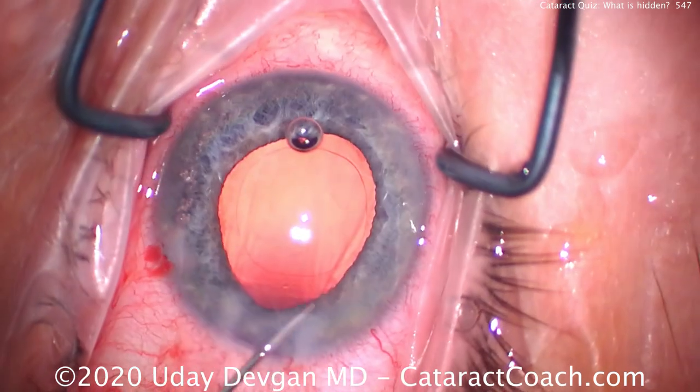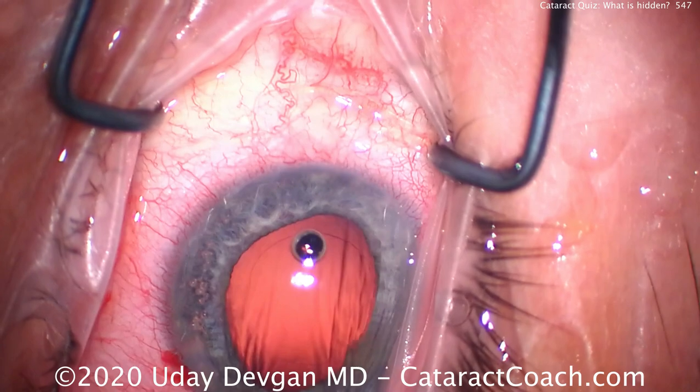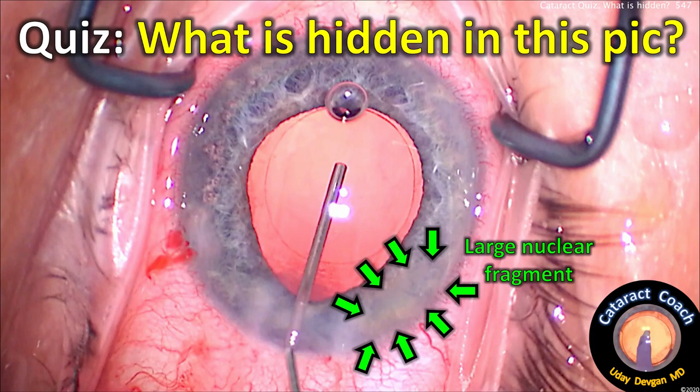This is a routine case — everything went great. There's a round rhexis and we're putting in some viscoelastic to fill the capsular bag. Whoa — what is that? Did you see it? That's the large nuclear fragment that was totally hidden.